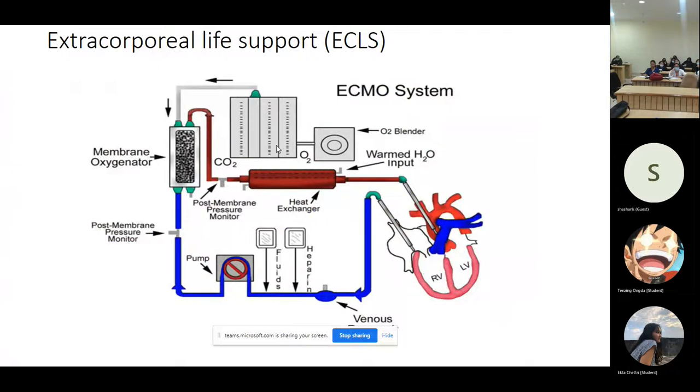In respiratory failure where the patient's hemodynamics are stable, with only respiratory failure present, venovenous ECMO is used, with two large cannulas placed into large veins. If a patient has respiratory failure and cardiac failure, with hemodynamic instability, then ECMO is provided as a venoarterial, VA ECMO system. In that, a large vein and a large artery are chosen for the cannulation. Clear till now?